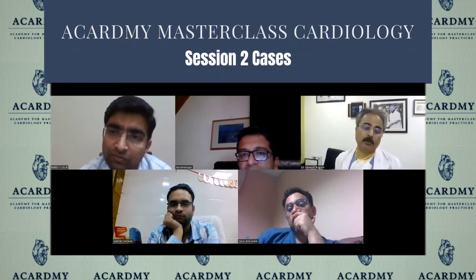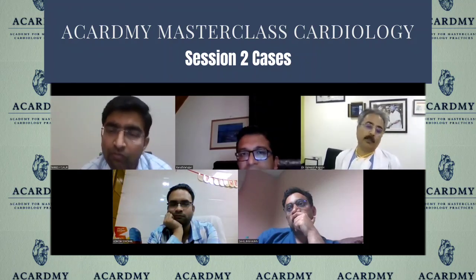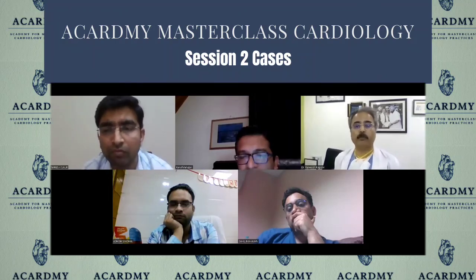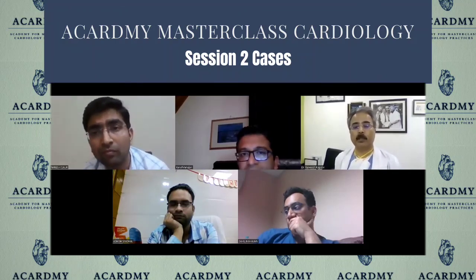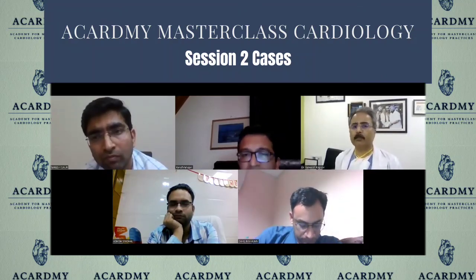The hormonal surges are very high. Prothrombotic chances and stent thrombosis rates are also high. So if it is absolutely a dual LAD situation and a very big diagonal reaching the apex, again it's a different situation. But here, this is my viewpoint. Finally, Naresh has managed it quite well, with all the TIMI 3 flows and very good kissing balloons.